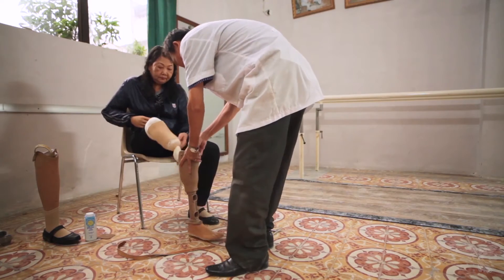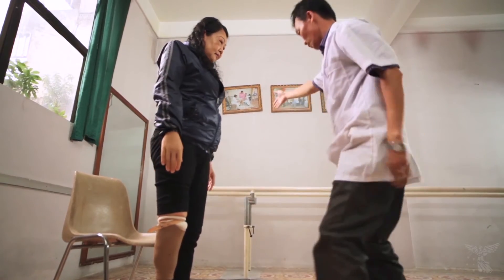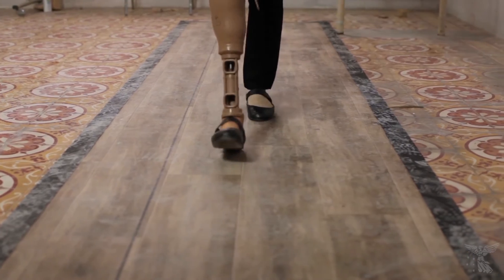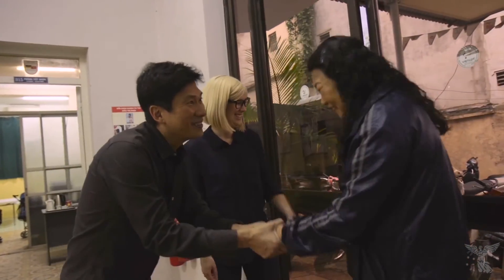This is then attached to standard ICRC Red Cross components, which they can use to adjust to the right height for the patient, and they align it so they walk properly and in a manner that's comfortable and efficient for them. And then it's done — they place a cover over the top and they're at the door.